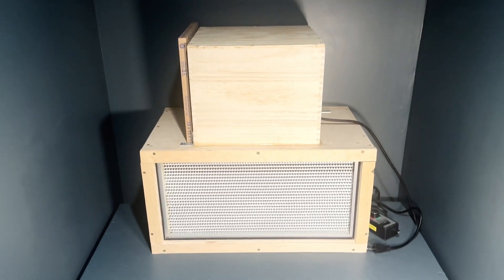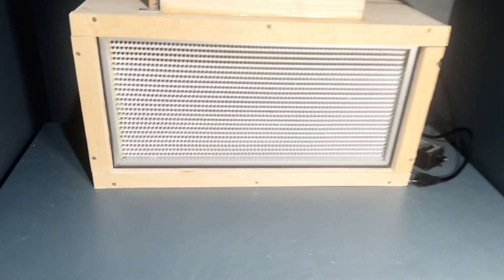The first optional item is a laminar flow hood. I built mine for around $450. I didn't make an extensive tutorial on building it, but there is a video that I'll link about building it.